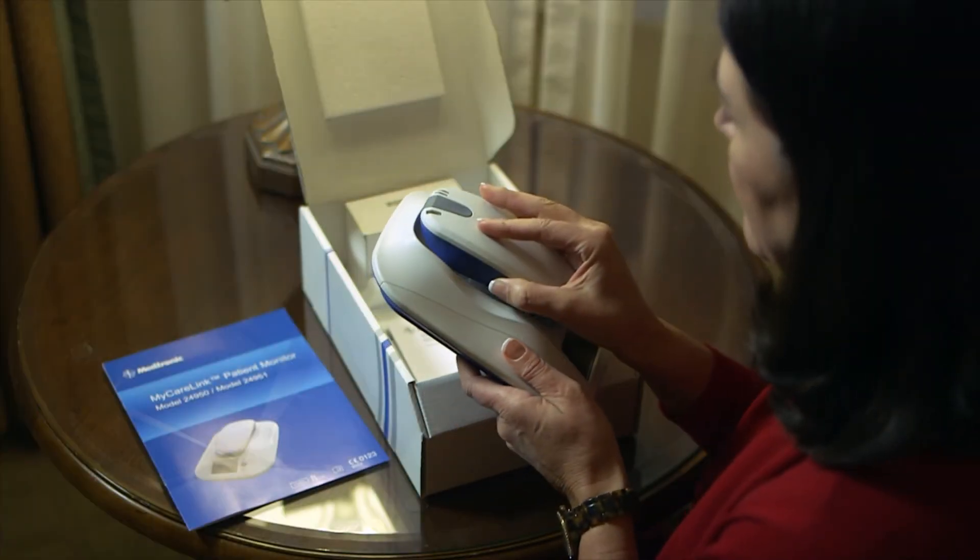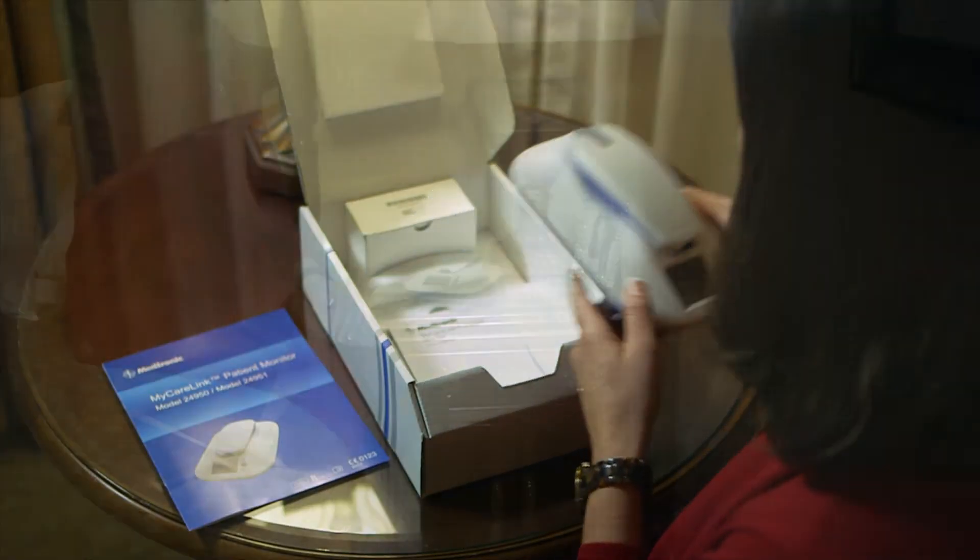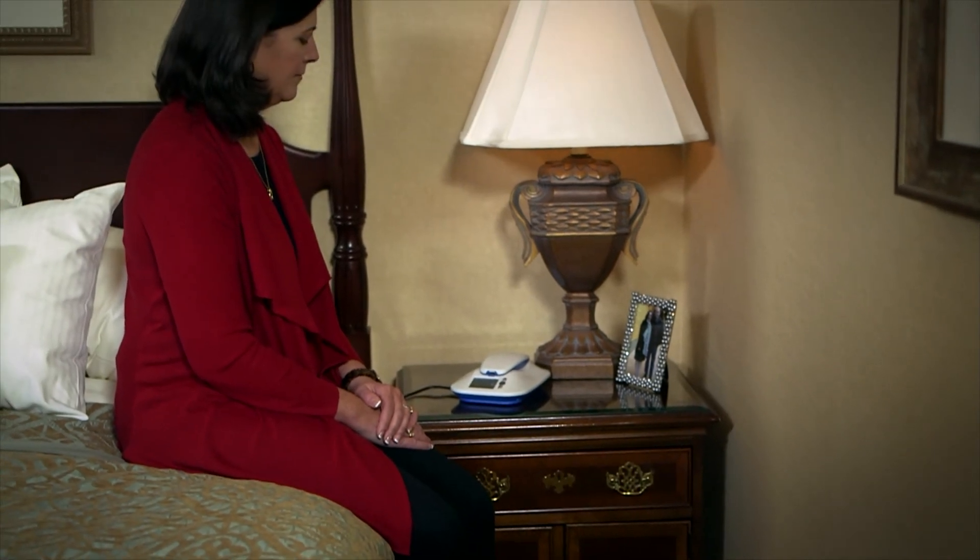As with all surgical procedures, there's a small risk of infection or sensitivity, but such instances are rare. After you get home and set up the MyCare Link patient monitor, the system is designed to take care of itself. Your doctor will contact you if necessary or discuss next steps at your next scheduled appointment. Continuous monitoring with the Reveal Link system makes it possible for your doctor to learn about your heart while you're free to live your life.